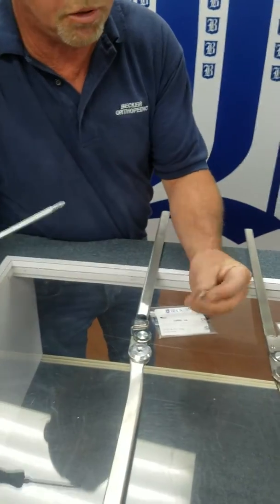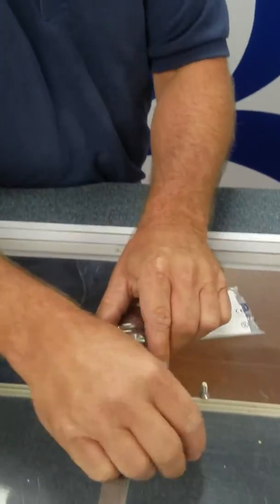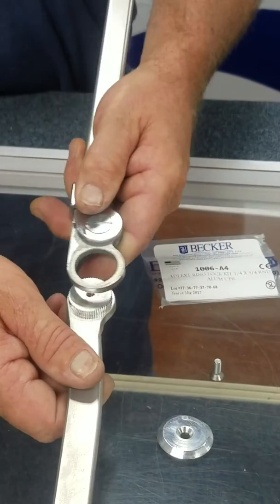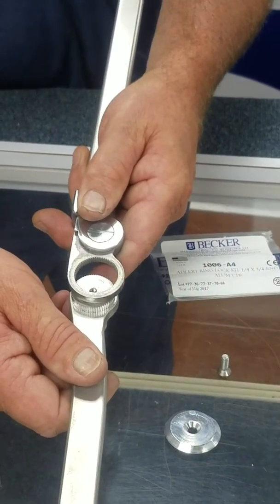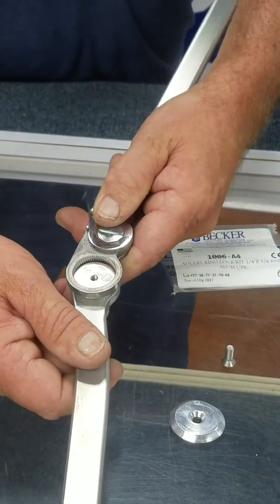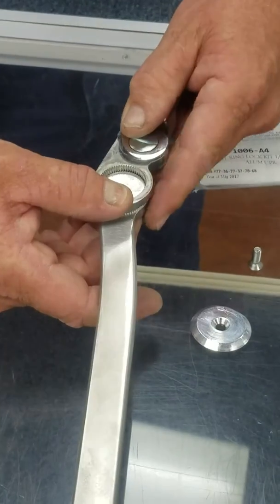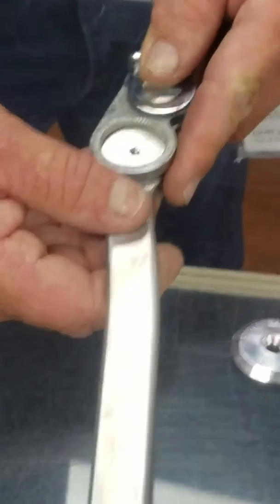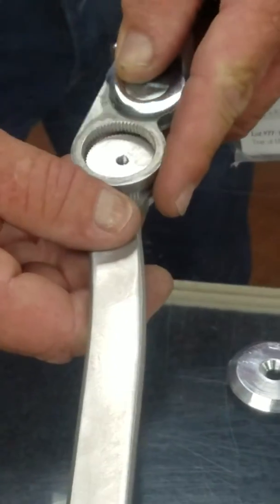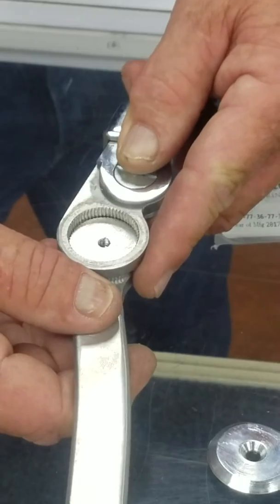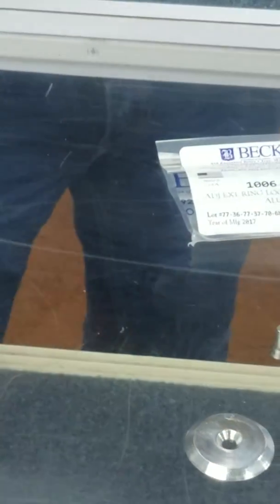It has an aluminum plate with a 1032 screw, and you can see there are many different increments that you can set the knee joint in, whether it be flexion. So we'll set it in flexion to show it.